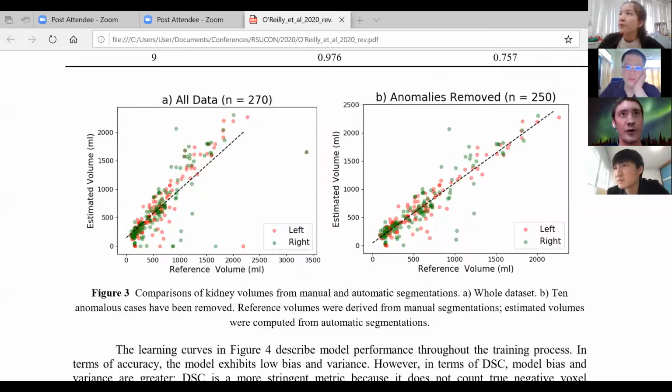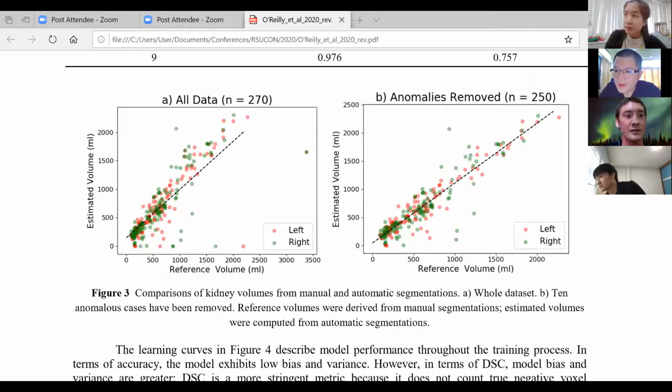We have 163 scans now. I still need to repeat the k-fold cross-validation with this larger data set, but at first glance, it looks like this is going to improve the dice coefficient by about 0.05. So it's getting closer to a 0.9 dice coefficient than 0.8.